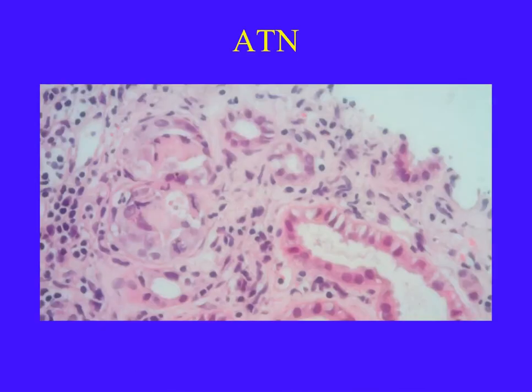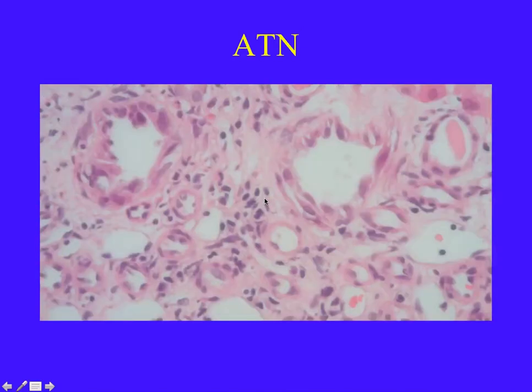So for example, here you can see these tubular profiles which are severely damaged with wide gaps in between the tubular epithelial cells. There is a variation in the nuclear size, with some of the nuclei being more hyperchromatic than others. We also spot some mitotic figures, which is an indication that this case undergoes through the regenerative phase of acute tubular injury. And there's also some cellular debris in the lumen of these tubular profiles. Similar appearances here with acutely badly injured tubules.